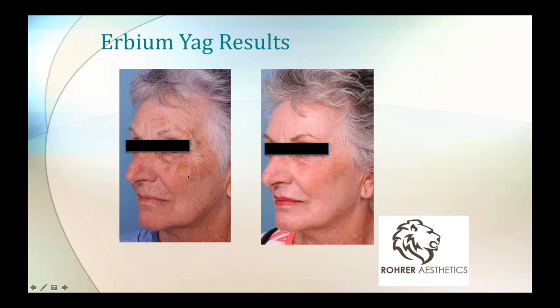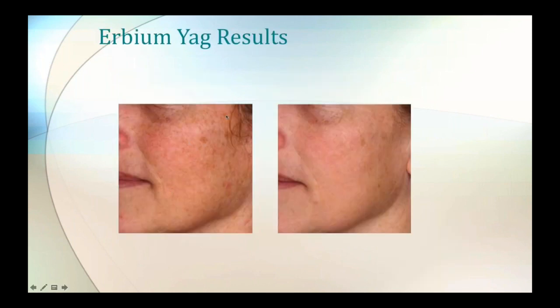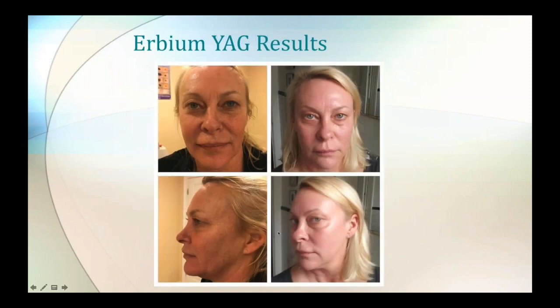You see on the pre-op all these brown spots, and you see how those are cleared. And what I would submit to you is, even if you have a CO2 laser, you would want to use the erbium on top of it to do at times a better job on some of these surface lentigines. Same patient here. This is what I love the erbium for, to take care of these brown spots, hyperpigmented spots. Once again, here's another patient, reasonable results, well represented results.